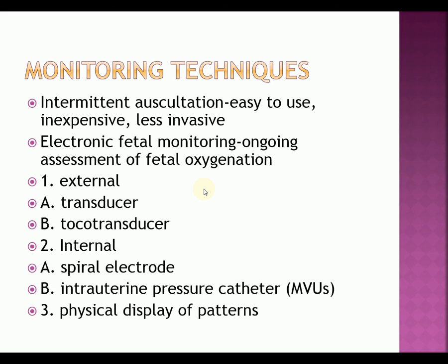You want to make sure your doctor realizes that they are exceeding that, because there's no point in using an IUPC if you're not going to use the results of the IUPC to manage your patient. And then, of course, you have your display of your fetal heart rate patterns. And we see a lot of the fetal heart patterns, and there's several different ones that we're going to talk about.